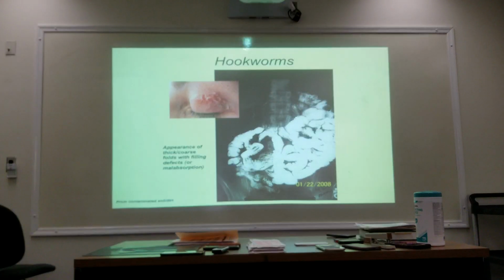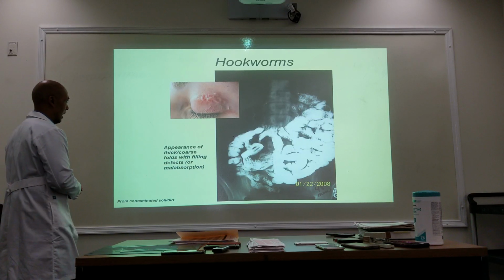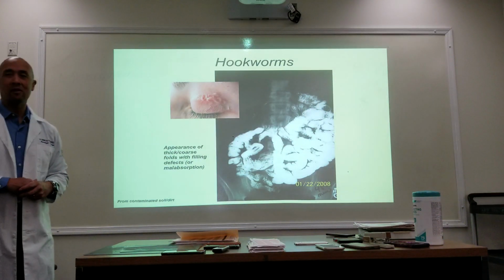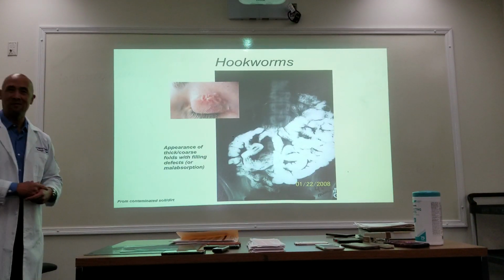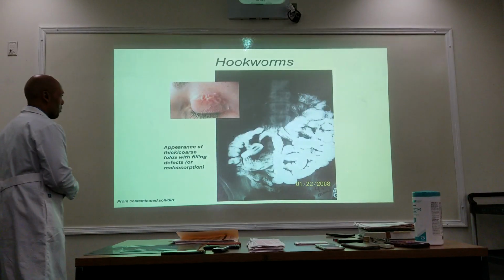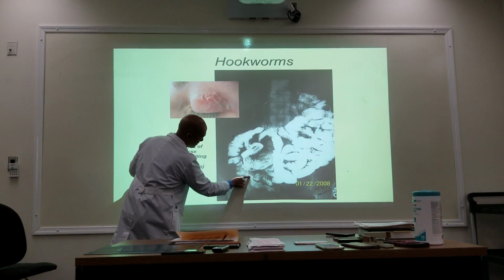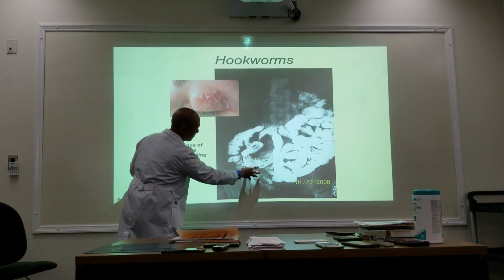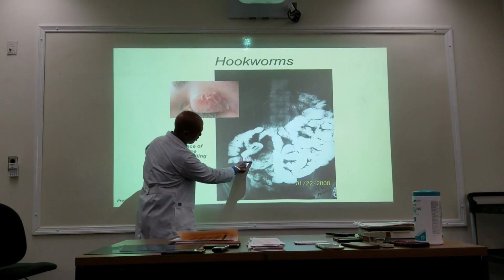hookworms. You guys didn't have that in your old slide. I just added this now. So there's your hookworms. I was trying to find a really good picture. The ones that I found would literally make you sick to your stomach if you saw it. So that's something that was a little bit more rated G. So hookworms, you can see these filling defects here. So these are all hookworms in the, what is this? This is the ileum. So the filling defects, you can see the squiggly lines in there.